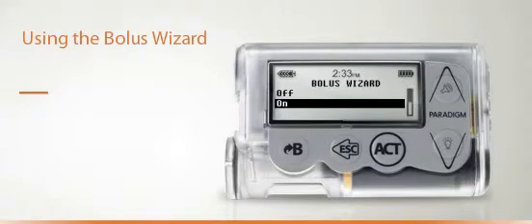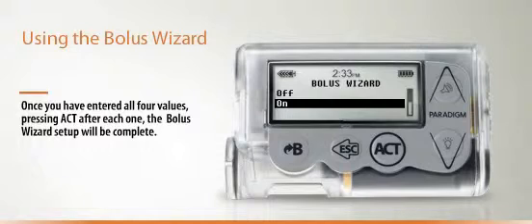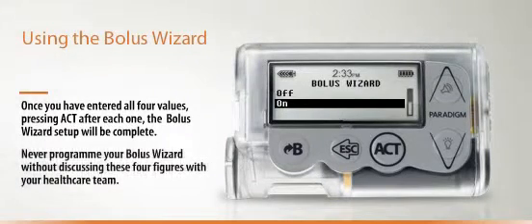Once you have entered all 4 values, pressing Act after each one, the Bolus Wizard setup will be complete. Remember, you should never program your Bolus Wizard without first discussing these 4 figures with your healthcare team. It is important you understand exactly what they all mean.